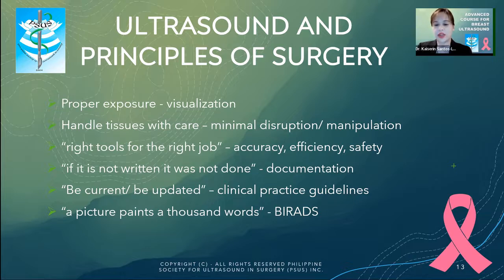As we plan our management, obviously using ultrasound when necessary, again, here we have to have the discipline to adhere to the following principles of surgery. So the first principle of surgery, proper exposure. With the use of ultrasound during our percutaneous procedures, we will actually accurately visualize the lesion. And although some BI-RADS 4 or 5 lesions may be palpable, we still use the ultrasound to see exactly that we are sampling different parts of the lesion.